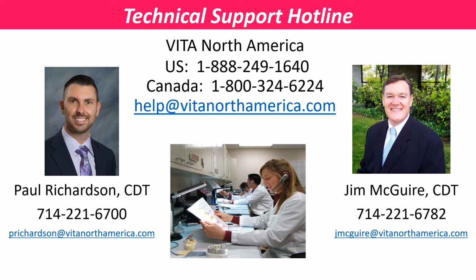What about the opacity choice of zirconia when doing pontics? When I choose a more translucent zirconia, it sometimes causes the pontic to be dark in the mouth. Yeah, that's really tough, and you're right, that's exactly the problem with light transmission. When we have zirconia over a tooth, the zirconia is only so thick, and even though the tooth root is dark, it transmits light differently or better than it does through the zirconia.